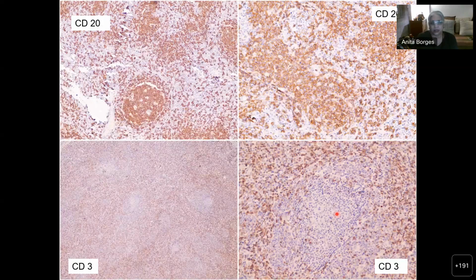And here you can see all kinds of lymphoid tissue. Here is a good mantle, a good reaction center. You know this is a reaction center because you can see the tingible body macrophages giving you this negative background. And you see a lot of B cells just hanging around in the background, not forming any kind of follicles, which is very odd. You can see large B cells in the interfollicular space, which are probably immunoblasts, which you can see over here.